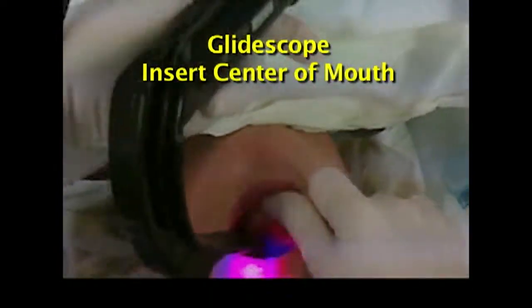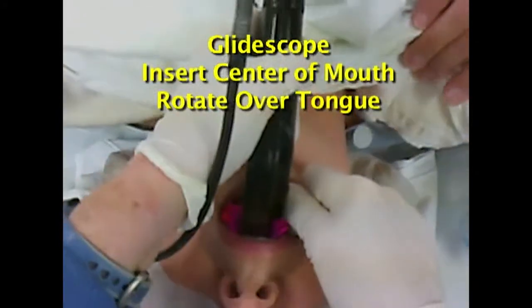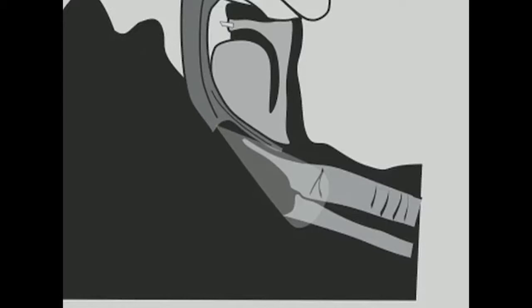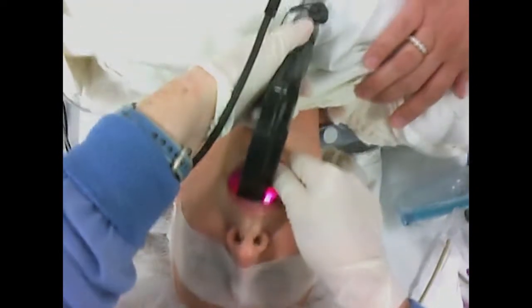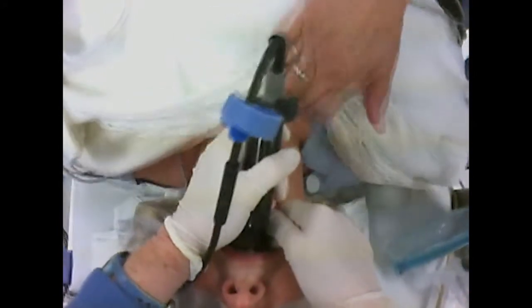Unlike the MAC, the GlideScope should be inserted into the center of the mouth and rotated over the top of the tongue. This position lines up the camera lens located at the tip of the blade with the larynx. Avoid the temptation to look at the monitor until you have placed the blade inside the mouth and turned the corner into the pharynx.